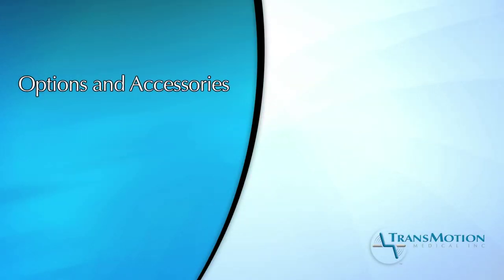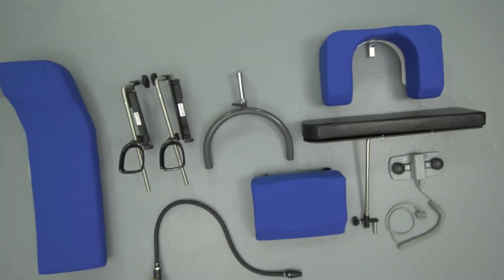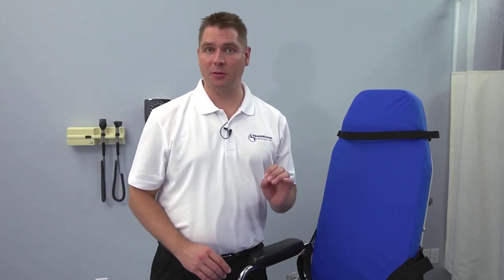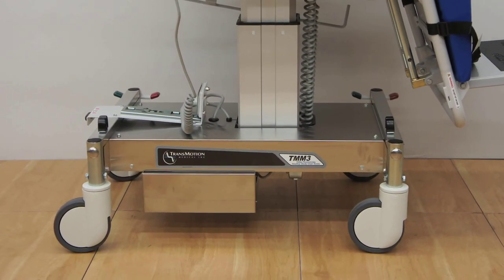The TransMotion Medical chair has been built with customized options and numerous accessories to help meet your specific needs. One option your chair might have is the S option, the short wheelbase. With this option, the base is 4 inches shorter to easily accommodate steel plates that are associated with some RF towers.